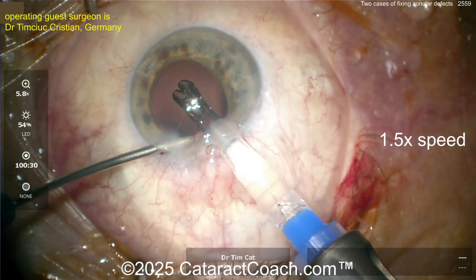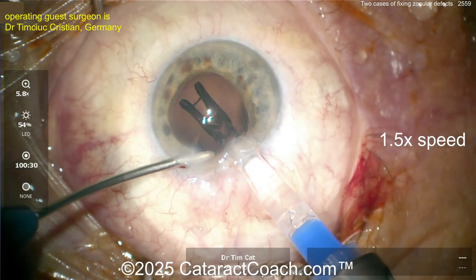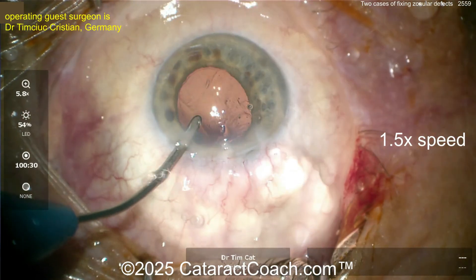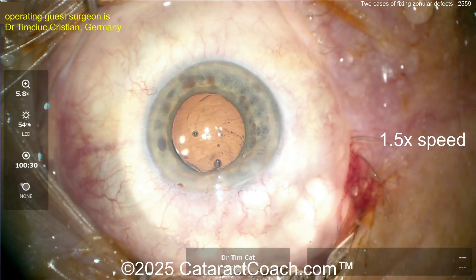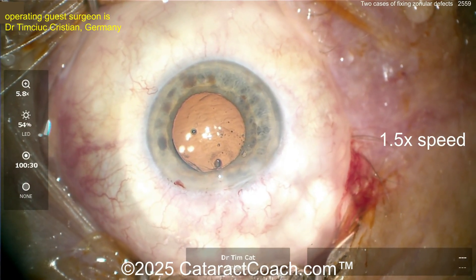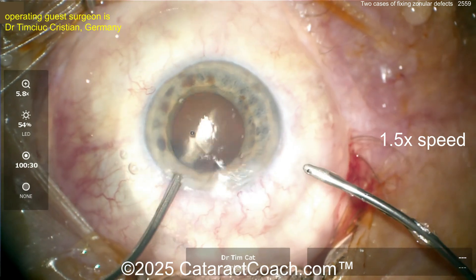Normal bag full of viscoelastic; here comes the IOL going into the capsular bag — that looks all good. During the cataract surgery, the nucleus removal and cortex removal everything looked fine. So now all you've got to do is take out the viscoelastic — call this done, right? Not so easy — watch carefully.